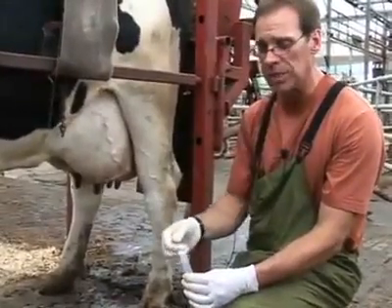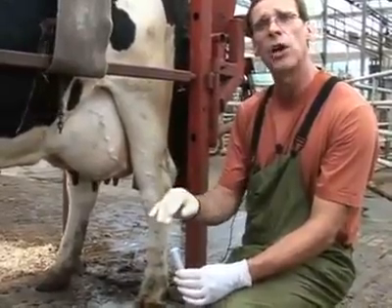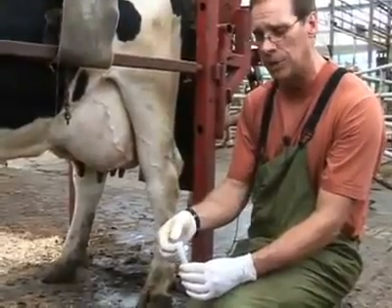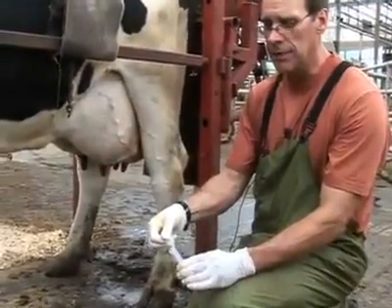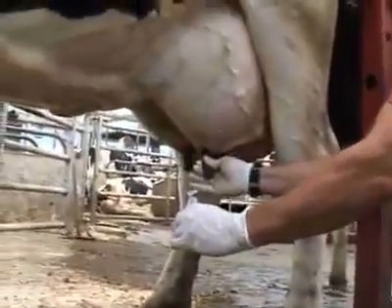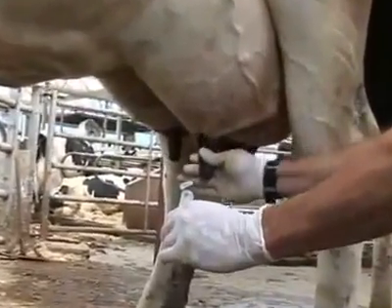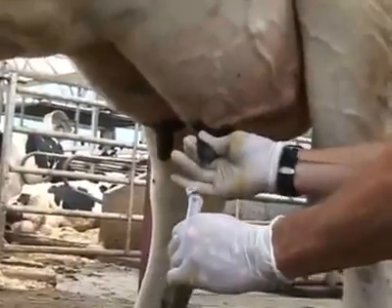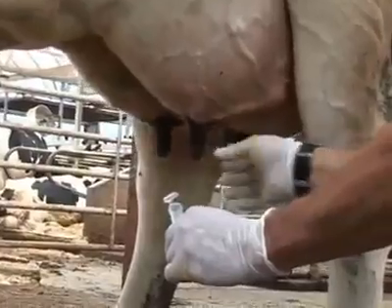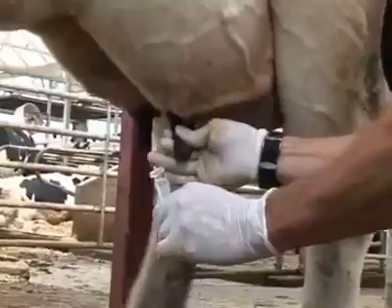The way that we avoid those is we allow the lid to be a protector so that stuff will bounce off of it. At the same time, we need to direct the stream of milk into the tube at an angle. So now I'm going to open the lid and leave it half open like this. At an angle to the cow's teat, I'm going to strip milk. The foremilk is first stripped away onto the ground, not into the tube. Once we finish stripping it onto the ground, then we collect the milk into the tube, again using our lid as a buffer to prevent any sort of material from collecting in the vial.